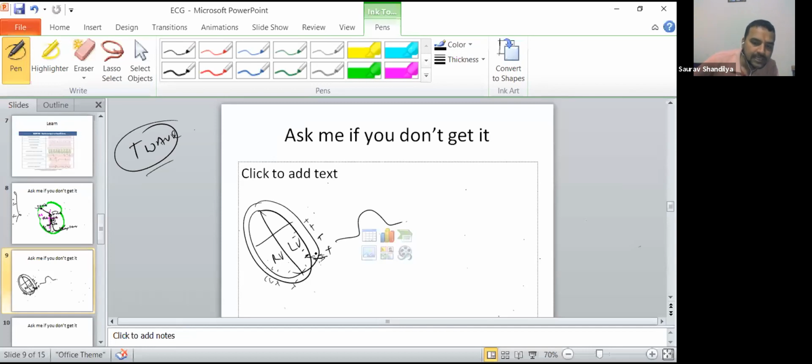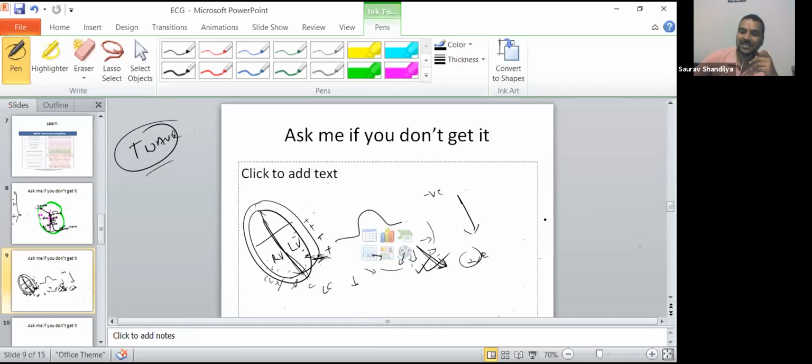Okay, go like this. So what happened here? If you see the current resultant vector, everything is going like this. The resultant vector is like this. There are many small currents like this, happening across the ventricles. So what is the resultant current? It is happening like this. So if you see the recording terminal, it flows from negative to positive, right? It flows from negative to positive, so definitely it is a positive deflection. T wave.